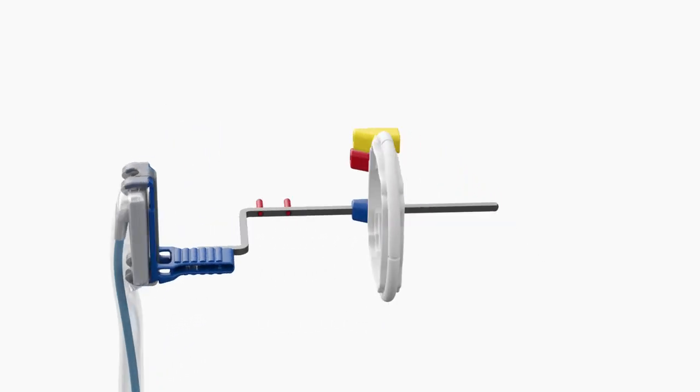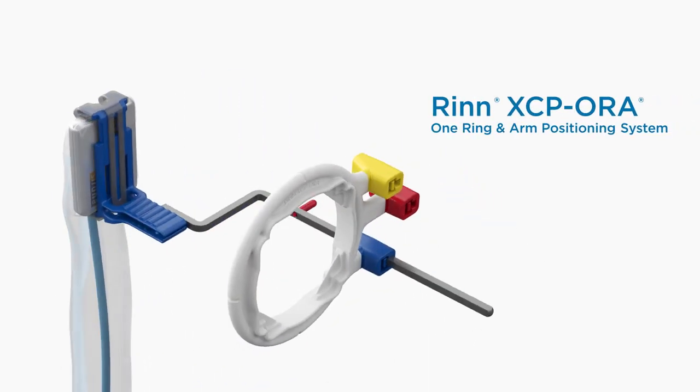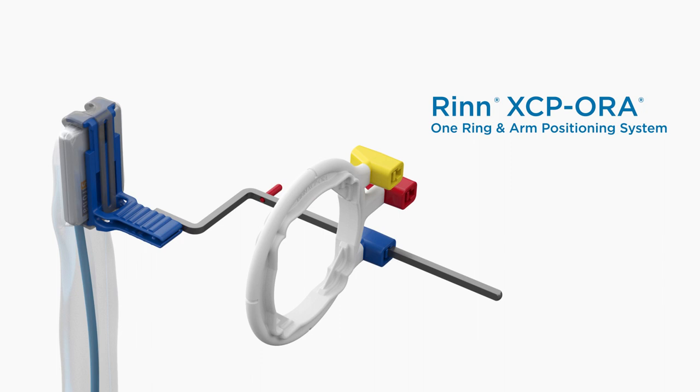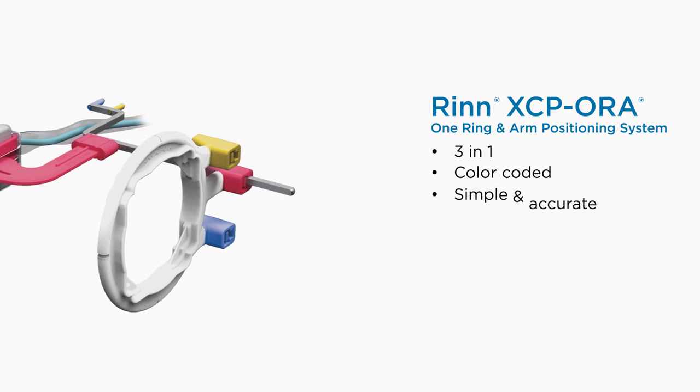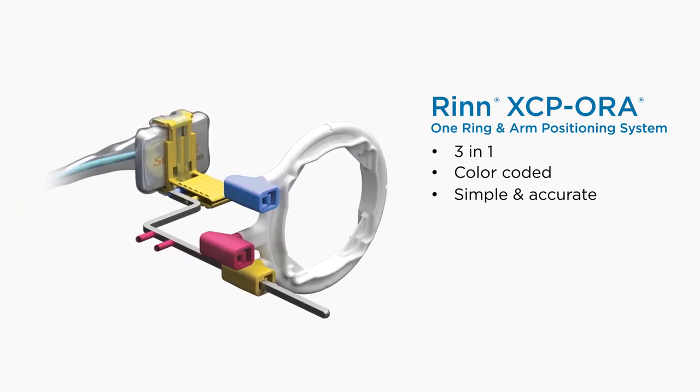With the Rinn XCP-ORA one ring and arm positioning system, the three-in-one positioning ring coordinates with the color-coded bite blocks for a simplified and more accurate paralleling technique.